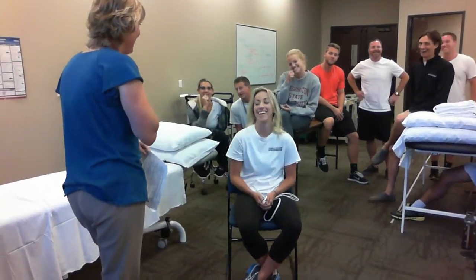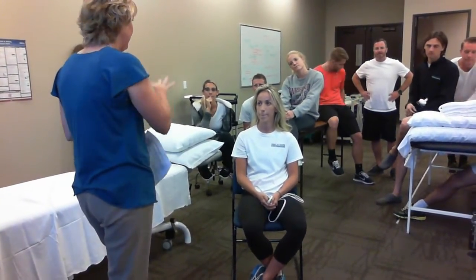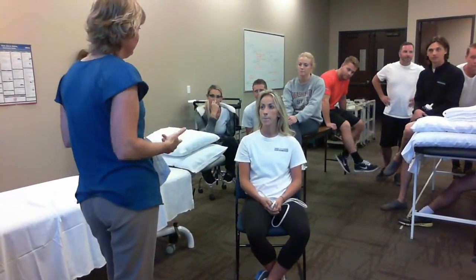Yes. Great. By chance, are you pregnant? Do you have a pacemaker implanted? Okay, great. Okay, and then because you're having a lot of shoulder pain, I'd also like to bundle it with cold. So I'd like to ask a few questions about that.